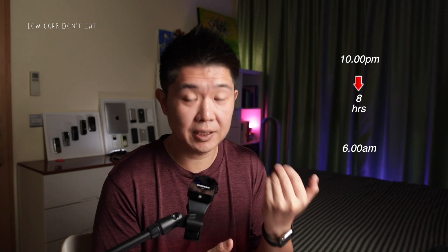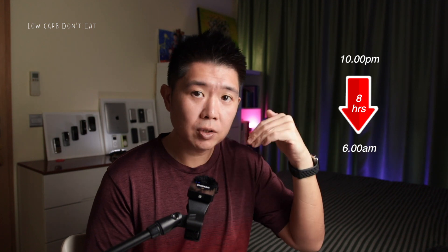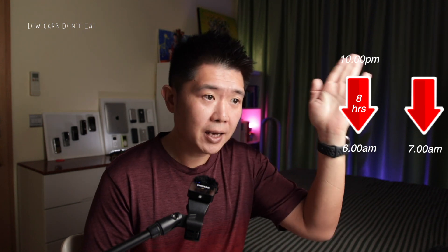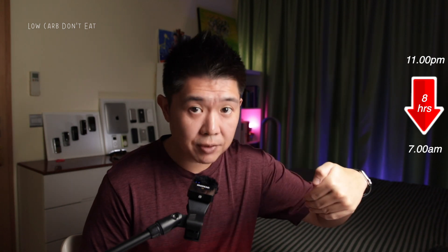If you move past the eight-hour timeframe, you lose some data. For example, if your last capture was 10 PM, you need to scan again by 6 AM. If you instead scan at 7 AM, the data from 10 PM to 11 PM will not be captured — only from 11 PM to 7 AM will be recorded. This matters more for people who may have glucose issues during the day or who tend to forget to scan.